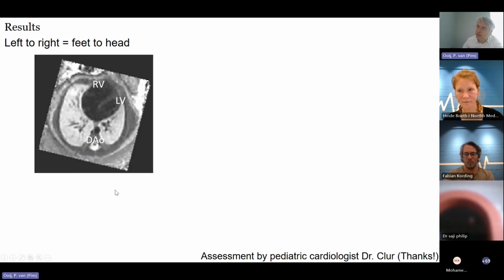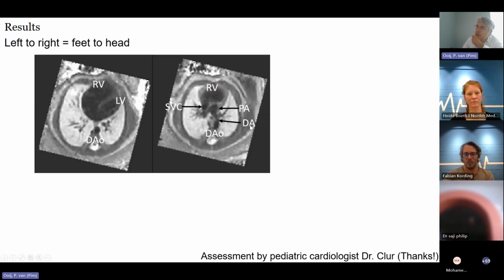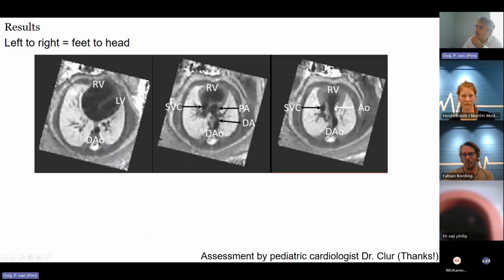Thank you. Okay, so LV, RV, then pulmonary arteries, the duct, descending aorta, and the aorta coming out of the RV.